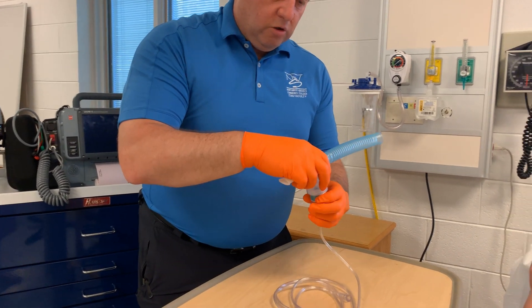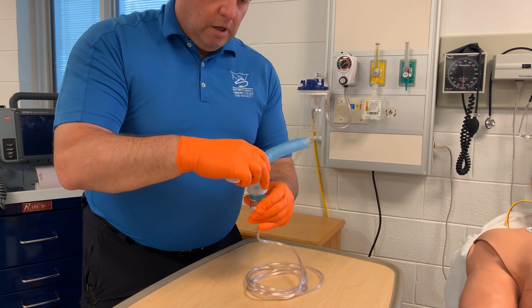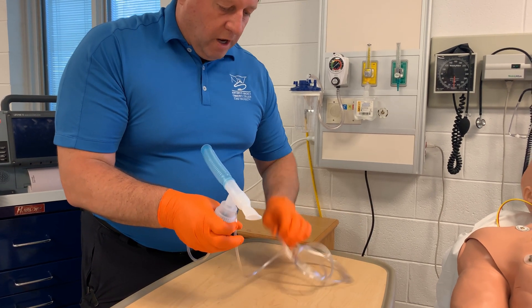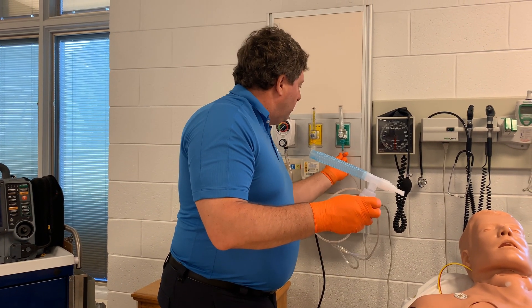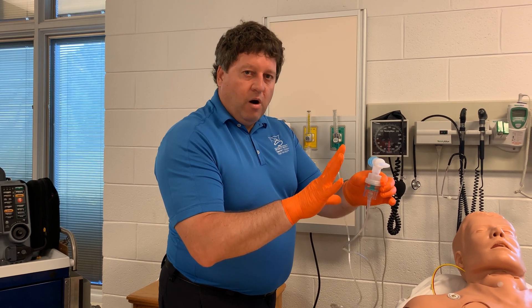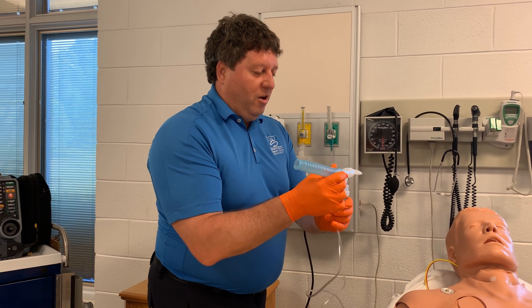At this point I usually screw it on, and if the patient can hold it I'll let the patient hold it. If not, you may have to do it for them. I'm now going to hook this up to oxygen — I normally do it at about five to six liters. You go much higher than that, you run the risk of putting too much pressure in this and blowing it apart, which makes a really loud noise. It scares your patient, sometimes scares your partner, and scares you a little bit too, so I don't recommend it.